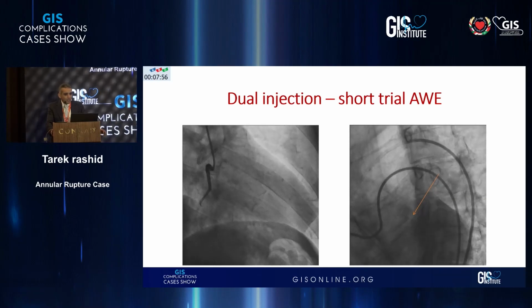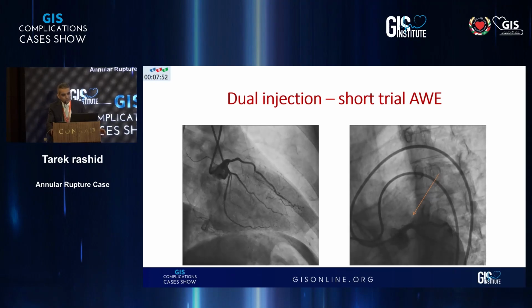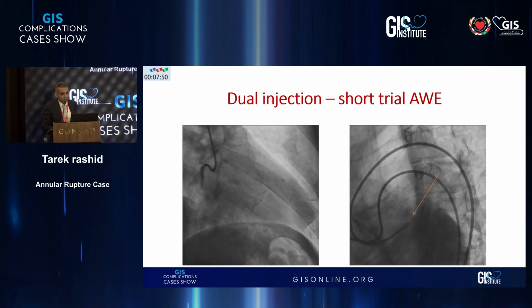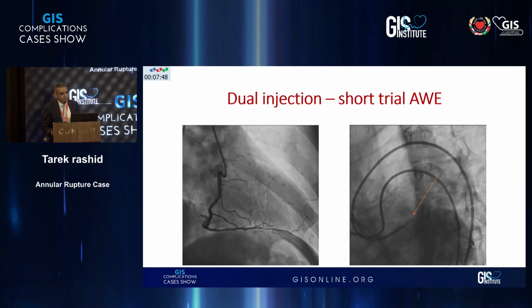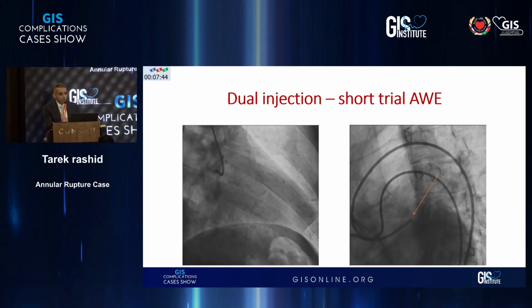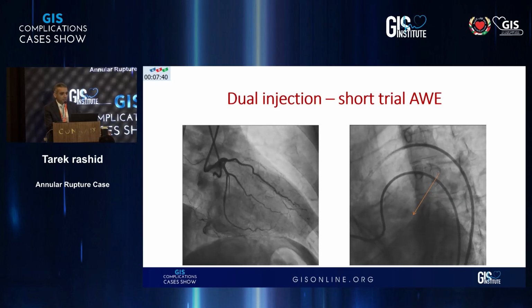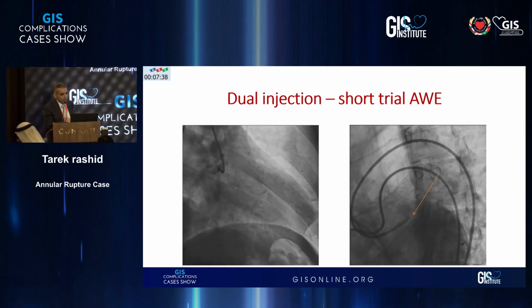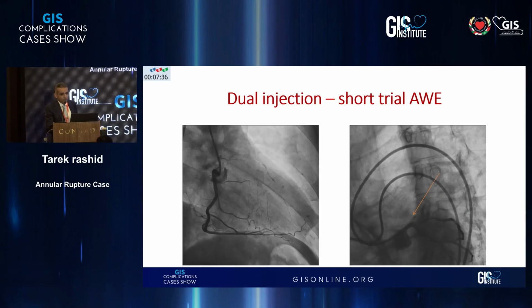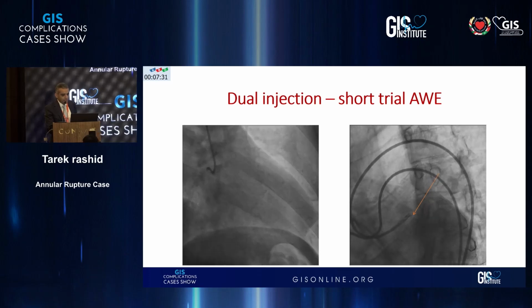With the previous trial, dissection, and hematoma, most of the time the wire goes into the subintimal space, and re-entry is very difficult in such a compromised distal lumen of the LAD. So we have an ostial LAD occlusion. It seems there are good interventional collaterals from the septal collaterals, but the distal target is not good. It's a diseased distal target.